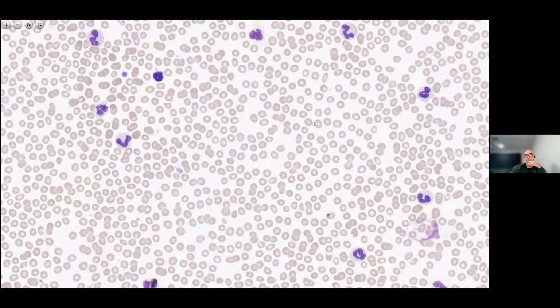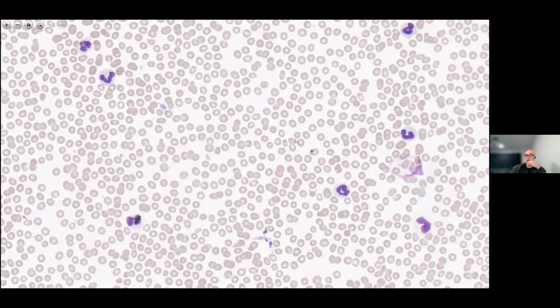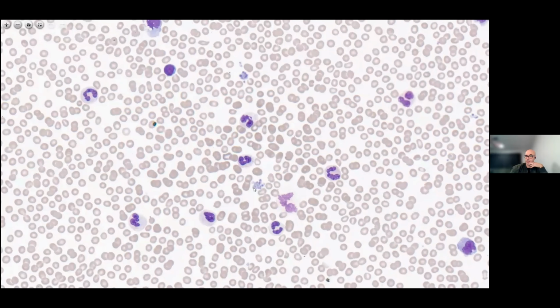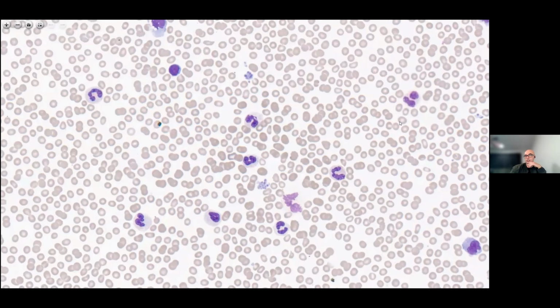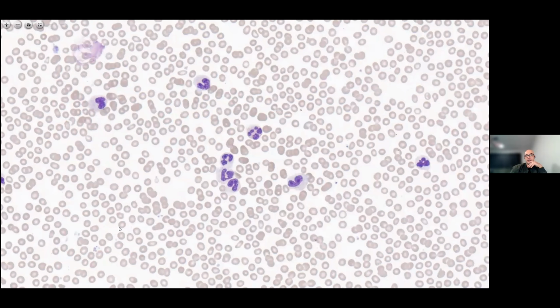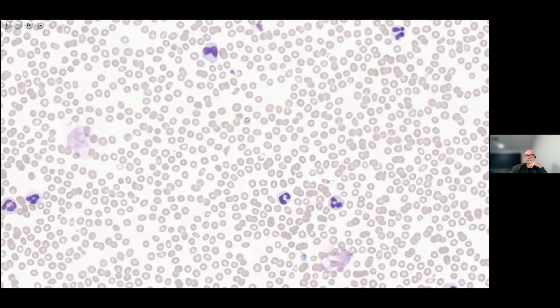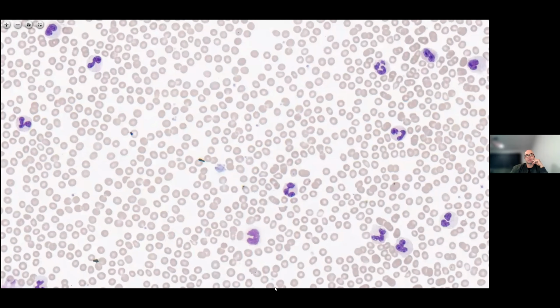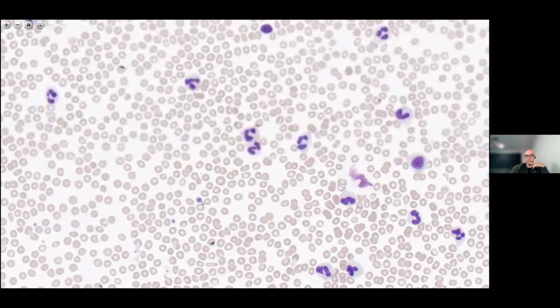And the platelets, we saw the platelet clumping, but you should also have a look at the platelets to see if there are significant numbers of large platelets, and at the granulation of the platelets. That might point towards an acquired condition like mild dysplasia or some dysplastic process, or a myeloproliferative process where you're getting large platelets forming, or maybe a congenital inherited condition where you can have large platelets.